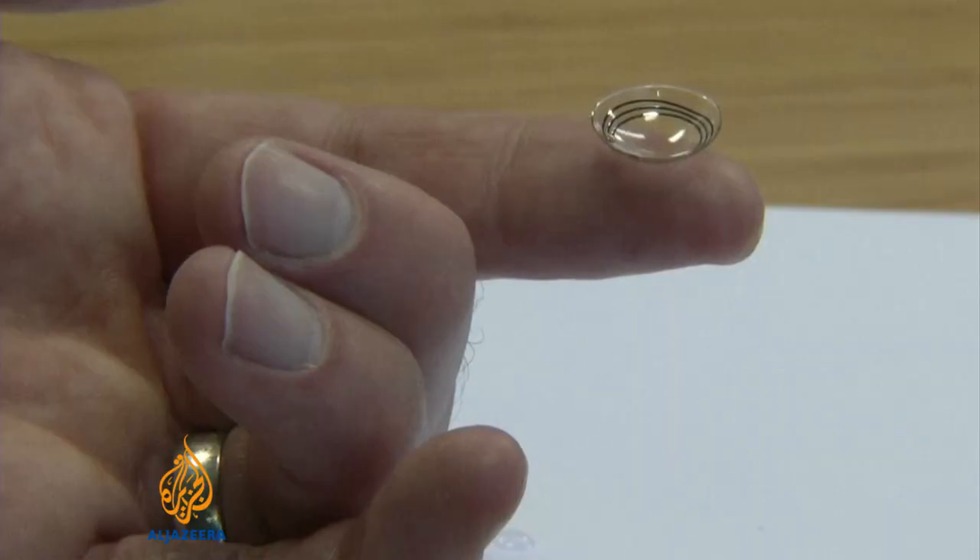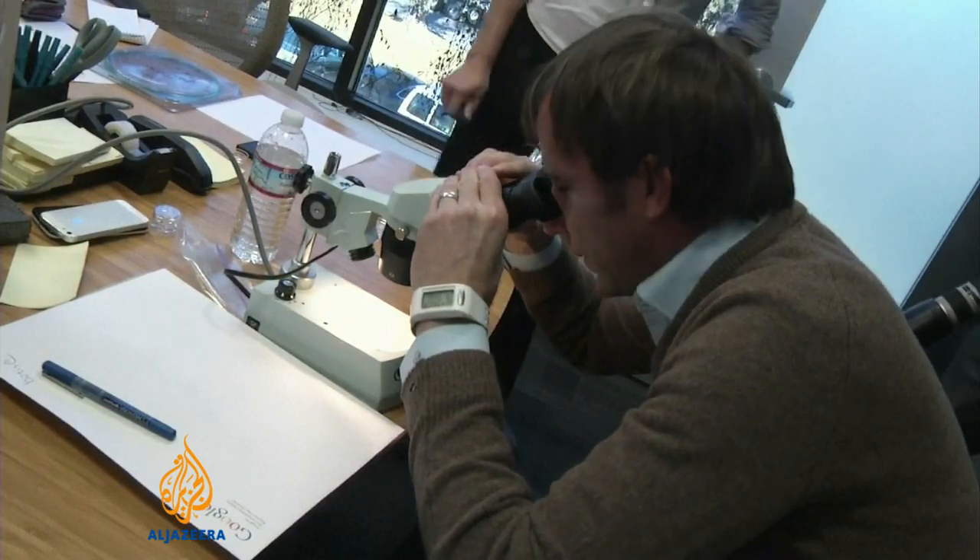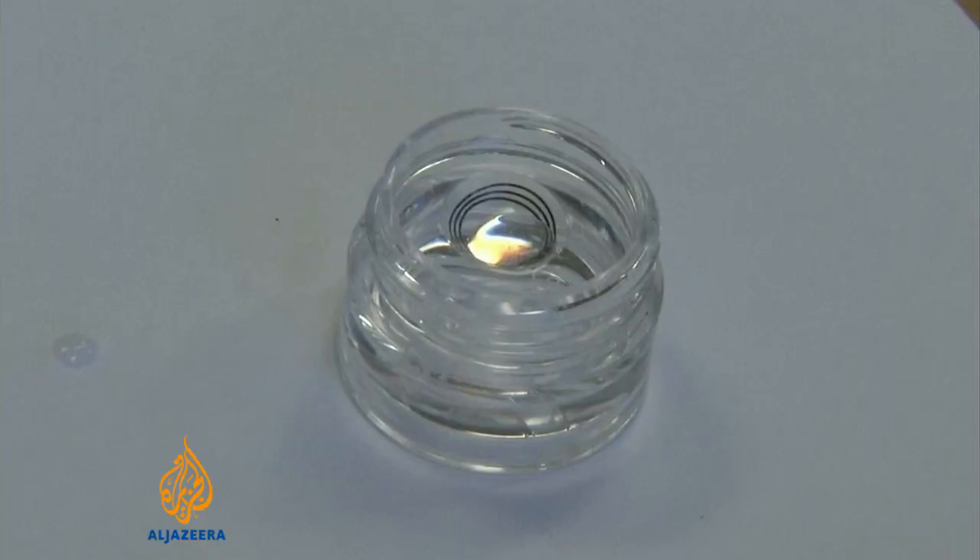We're testing a smart contact lens that we built that measures the glucose level in tears using a tiny wireless chip and a miniaturised glucose sensor. This prototype looks and feels like a regular soft contact lens, but inside of it we have a tiny chip and a miniaturised glucose sensor that allows us to continually monitor tear glucose levels.